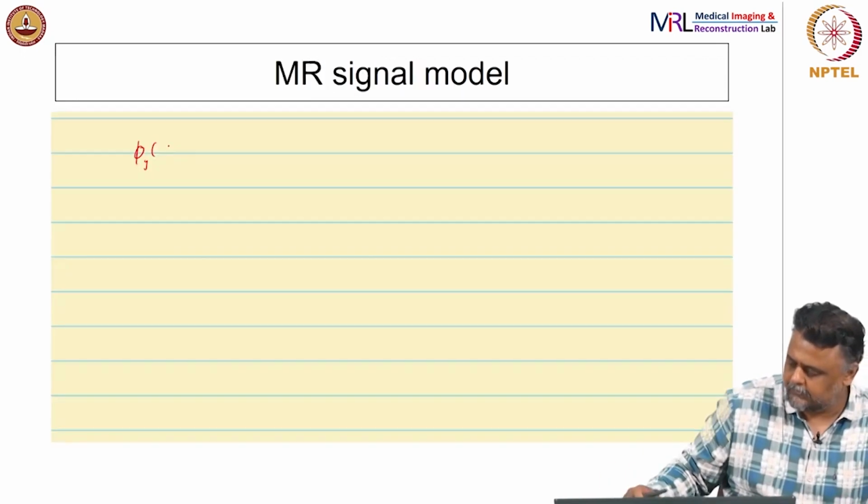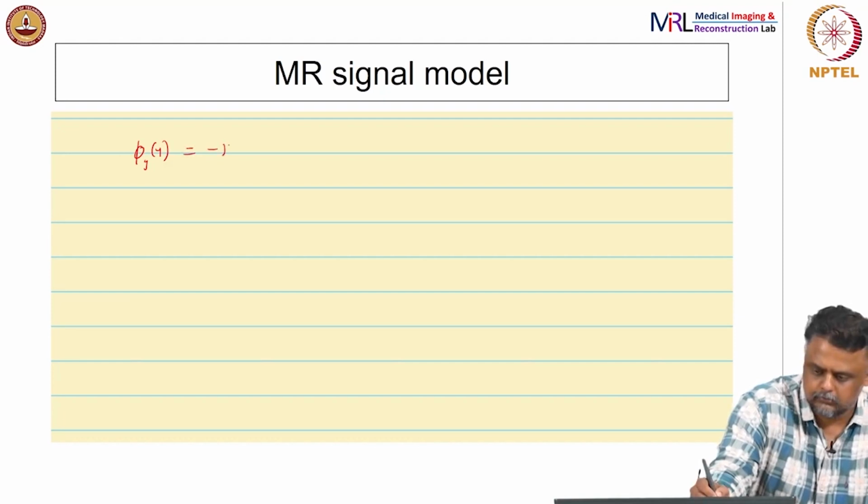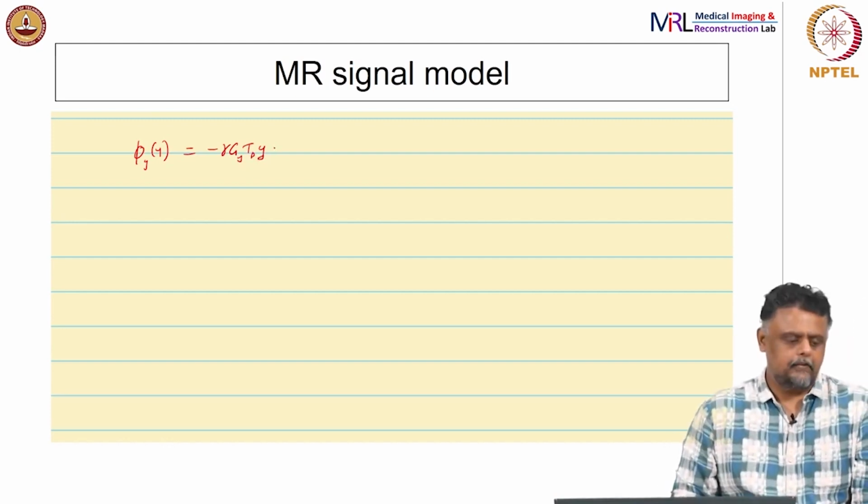The phase accumulation, like I mentioned before, is a function of position. This is a phase accumulated.